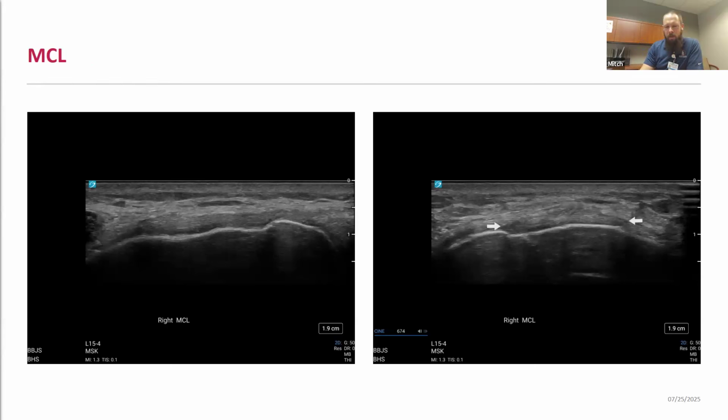In talking about diagnostic ultrasound and initial setup, especially when I'm working with our fellows, I talk about first finding your bony landmarks when you're trying to identify your anatomy. Soft tissue can vary widely between patients, especially when evaluating normal versus abnormal pathology, but bony landmarks stay relatively the same between patients. And so finding your landmarks, kind of finding your home base with those bony landmarks, is key to getting everything set up and evaluating these other soft tissue structures.